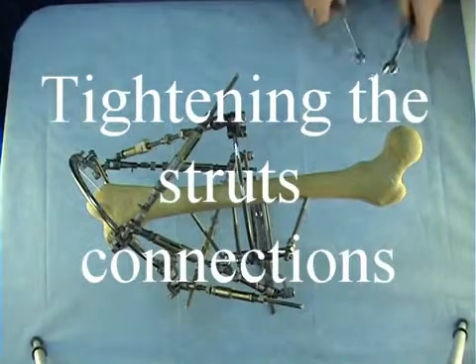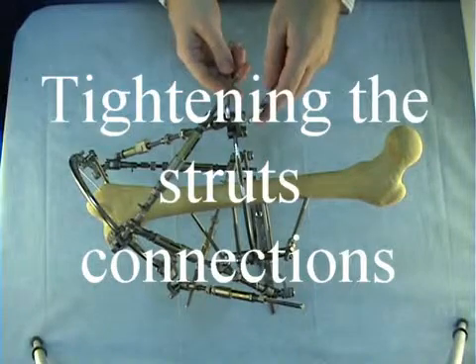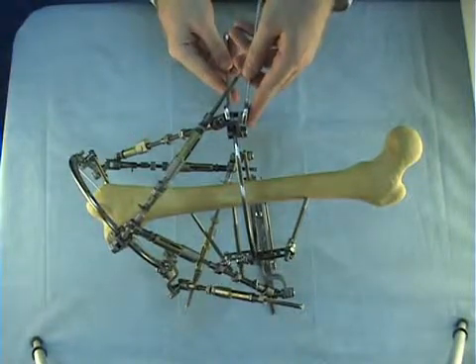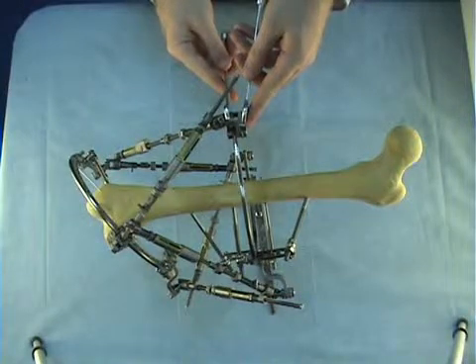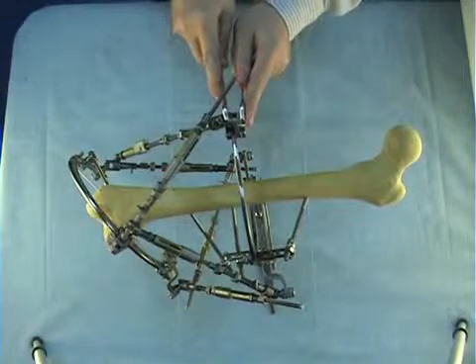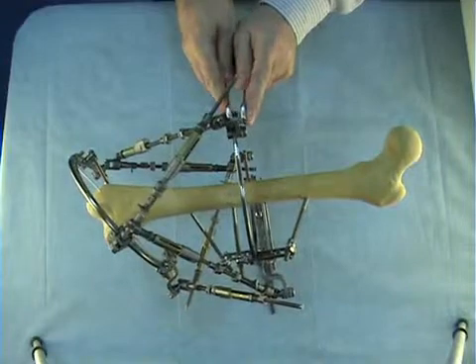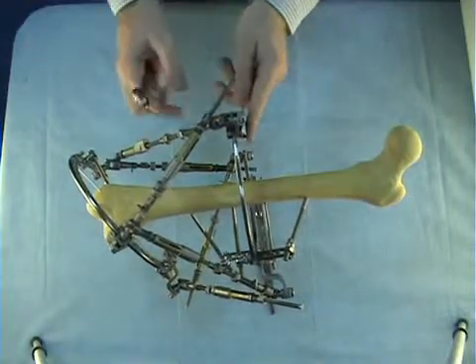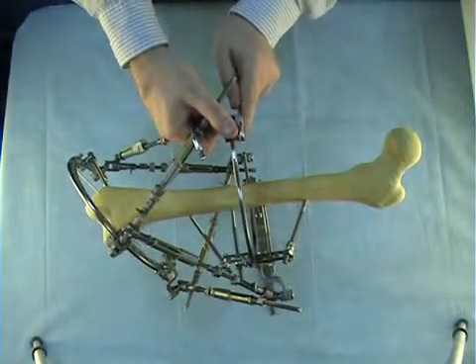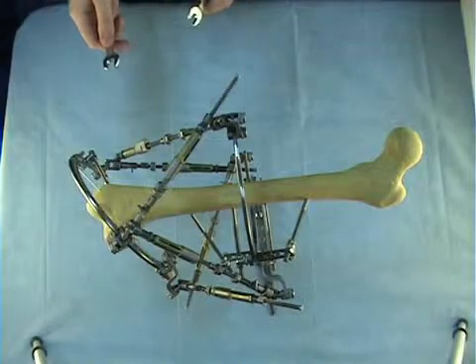Then we tighten all nuts and connections of the assembled struts. We use two 12mm wrenches when tightening the connection of a strut joint with a plate or a ring. When tightening the bolts fixing the plates, we use one wrench. We have to tighten all connections between the struts and the rings.